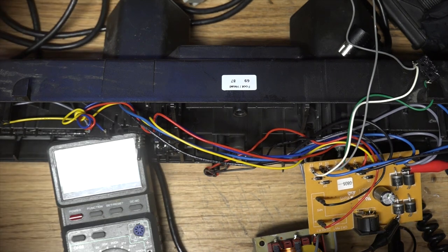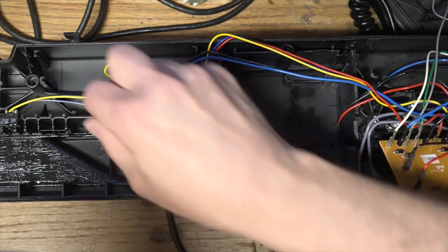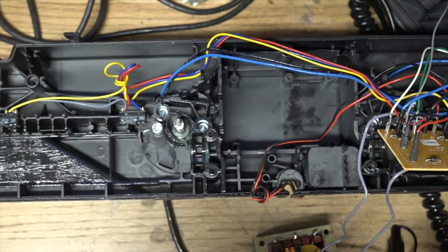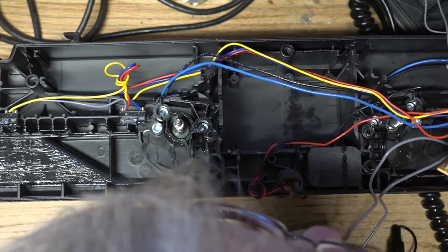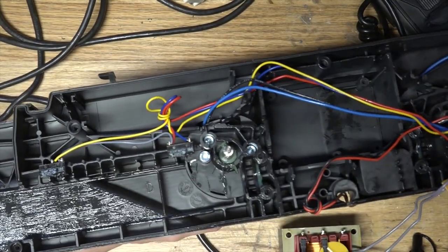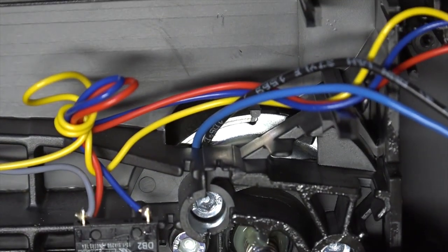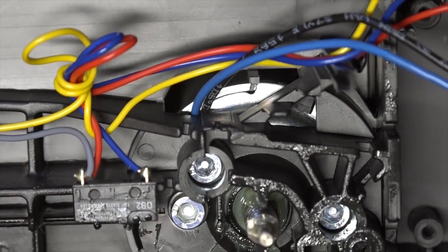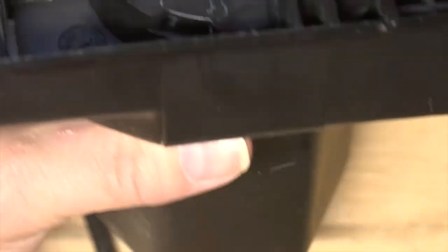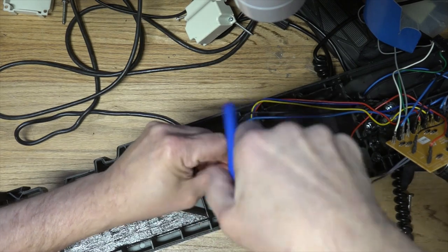Let me unplug this guy again. It's very, very nicely built. Everything, except for the switches, has covers on their little jumpers, almost all of them. An odd combination of screws here. You can see that we've got a screw over this side and that side, and then one right here. Seems a little odd to me. And we'll just grab those three screws out of there and we'll see what falls off, if anything.